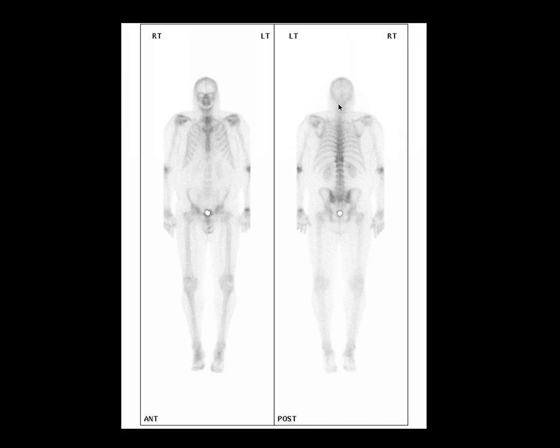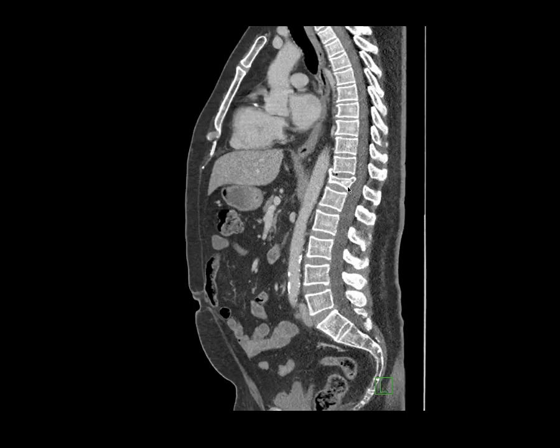How long does a fracture show up on a bone scan? It's very difficult to say. You can see activity from tibial fractures sustained maybe 40 years ago, whereas rib fractures will often be invisible when the trauma was two or three years ago. One patient with a wedge compression fracture demonstrates only very low-grade activity in the lower thoracic spine, and their CT scan shows wedge compression with osteophyte formation, indicating a long-standing process.